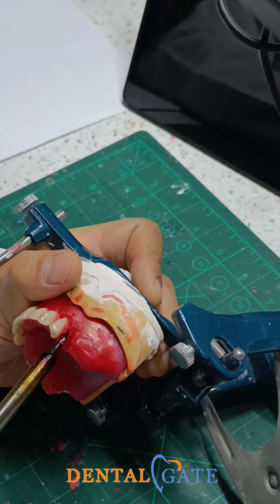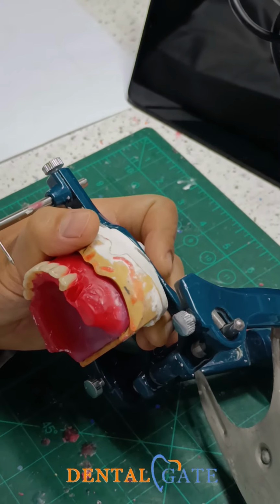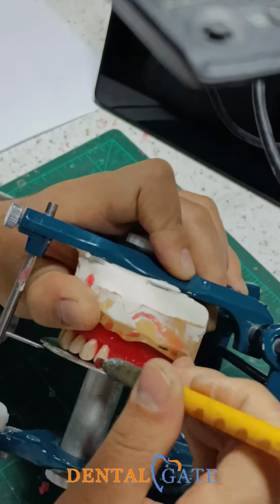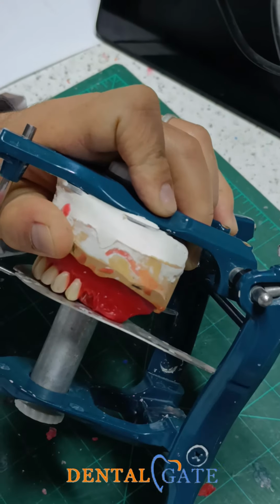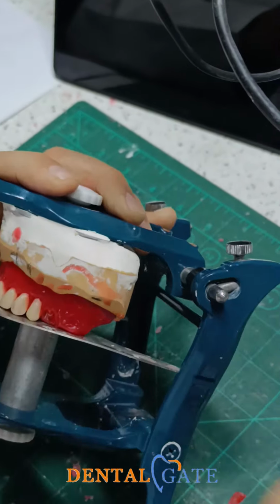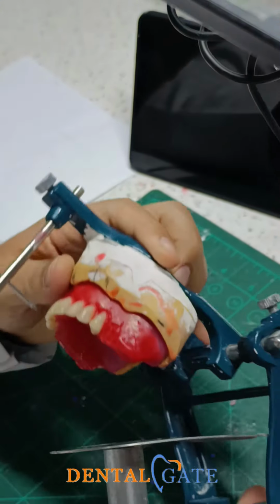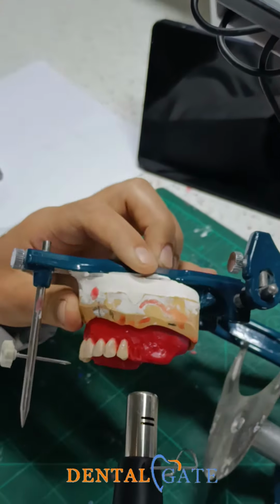So consequently, we can start with the second premolar now. I mean, there is no severe space here, okay? Yes. Now I can start with the second premolar.